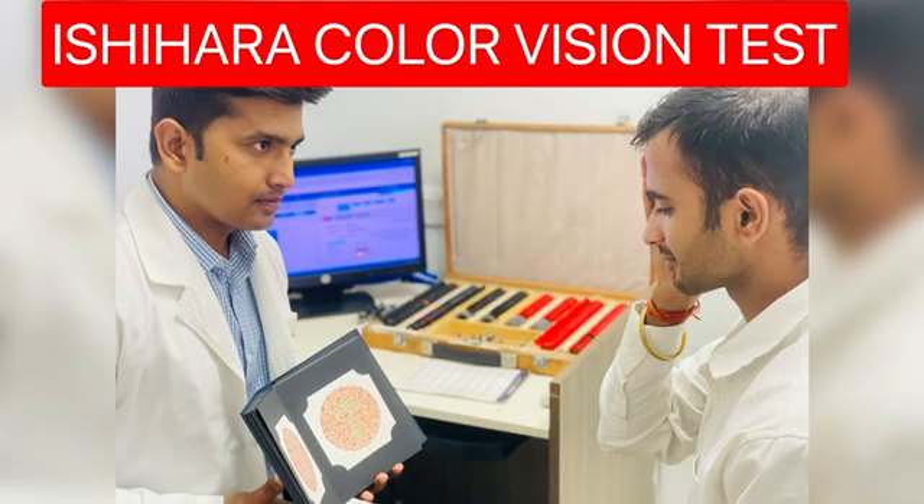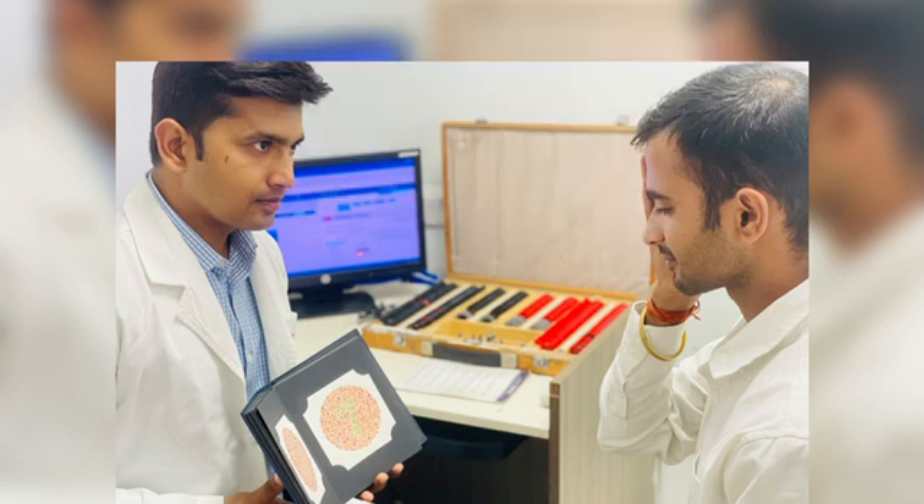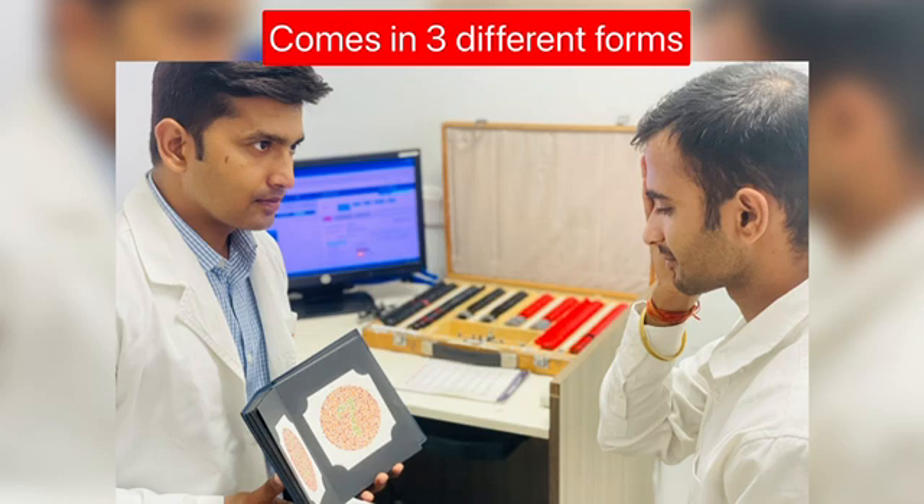This video is all about a very well-known and widely used test for color deficiency. We are going to discuss the Ishihara color vision test chart, which is based on color confusion and contains pseudoisochromatic plates. It is a screening test for red-green defects, also known as protanopia and deuteranopia defects.